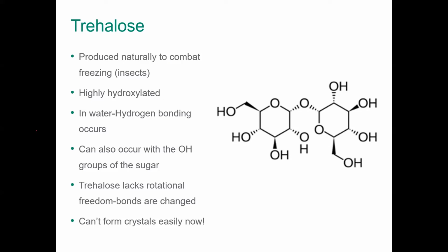They use glycerol and trehalose in nature, because they have trehalose in their blood, which helps them go through the whole winter and survive it at the end.